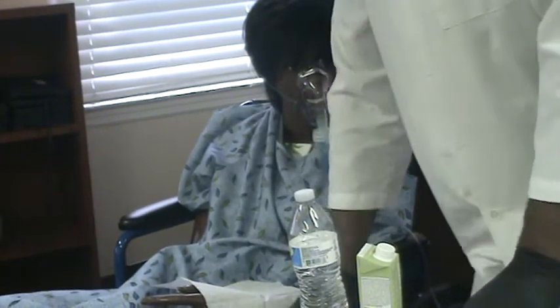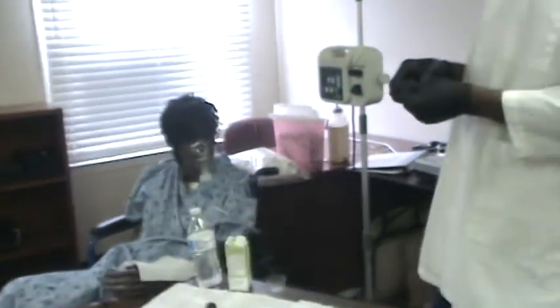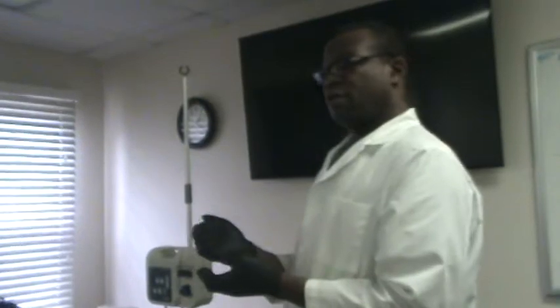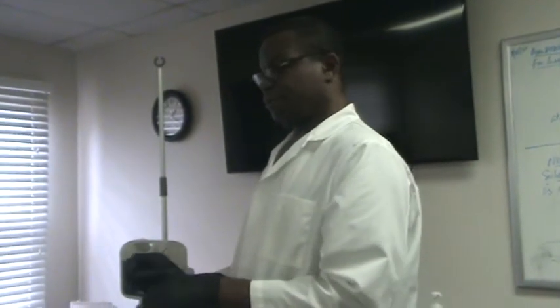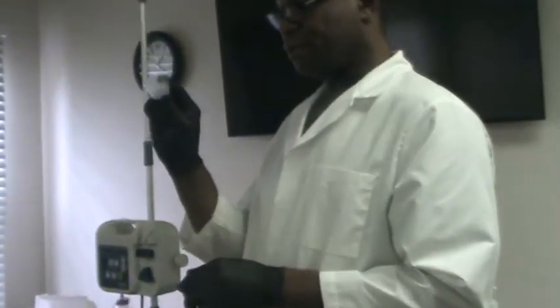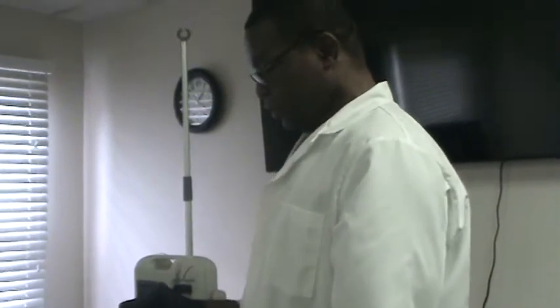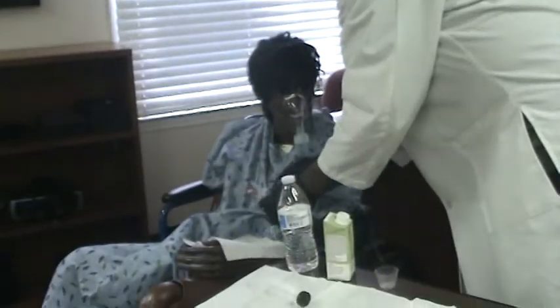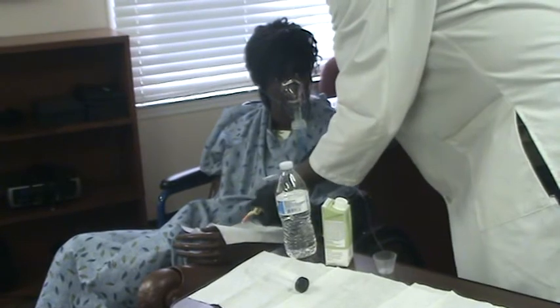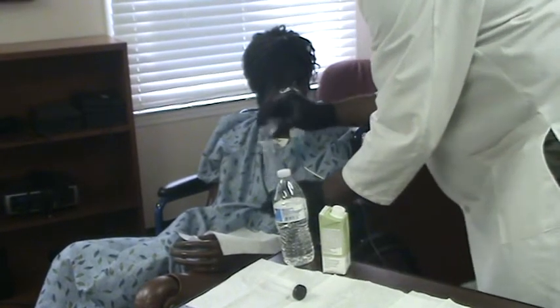If you're giving medicine in pills, you will crush the pills, pour them in a cup, and put a little bit of water, like this much water per pill, in a larger cup. Then you would flush, the same thing that we did, and after you flush, you've already prepared your medication. Then you just pour the medicine in there.